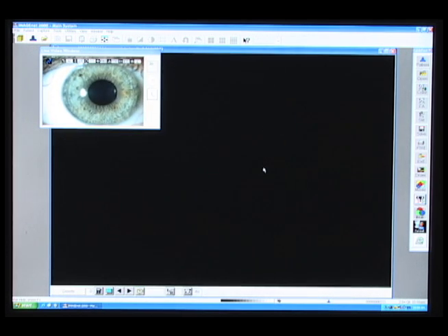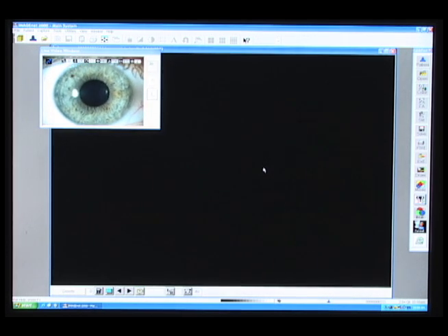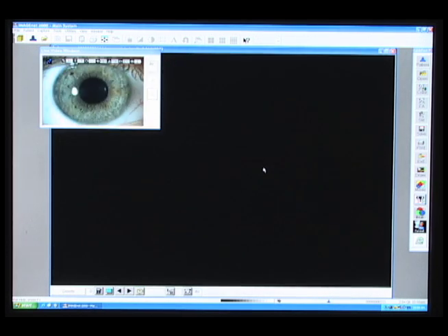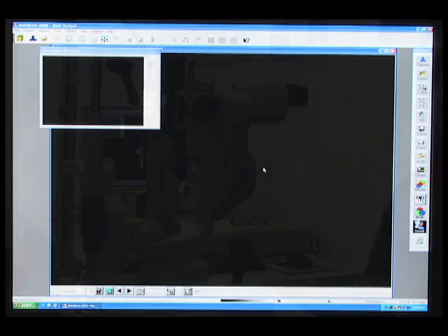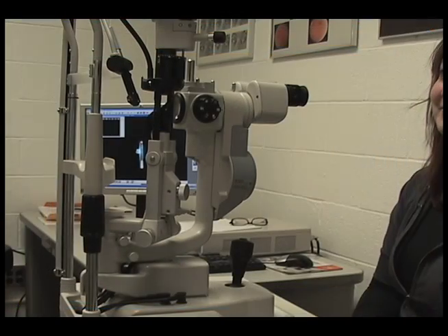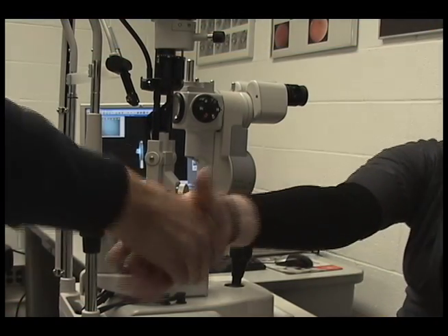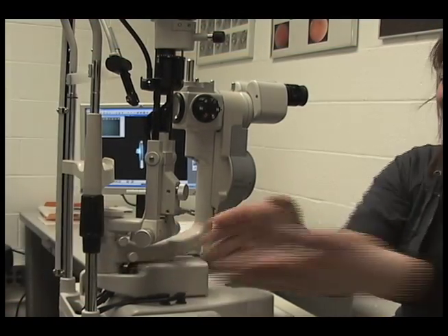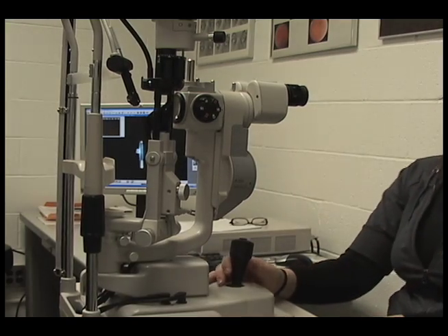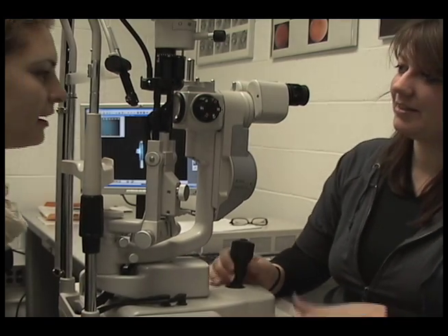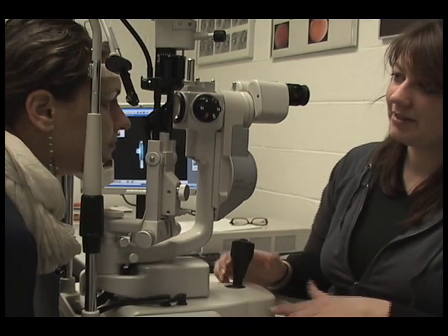At the beginning of a session, start imaging with a low magnification and diffuse light. Then start to increase the magnification and make direct slit lighting.